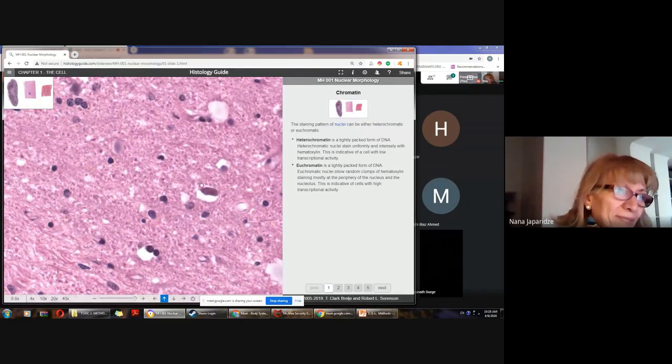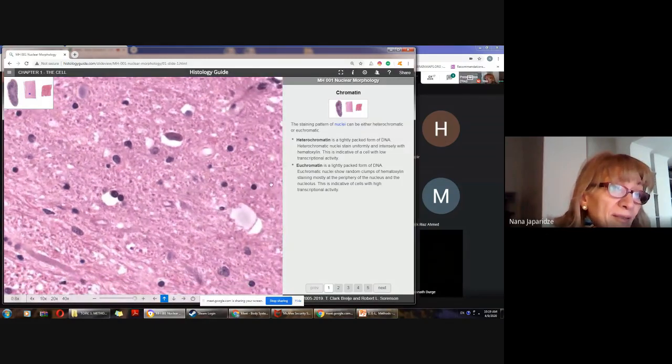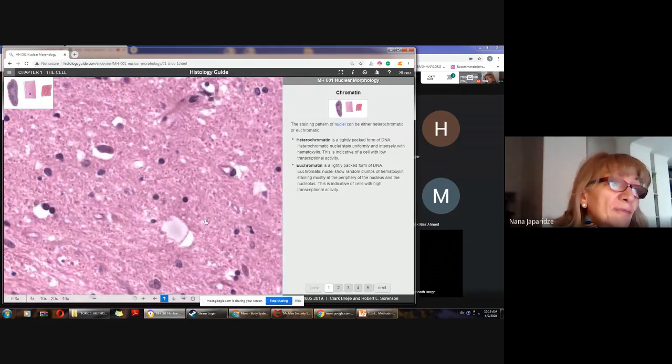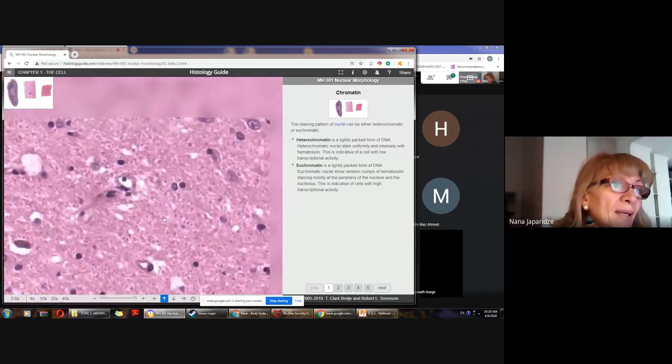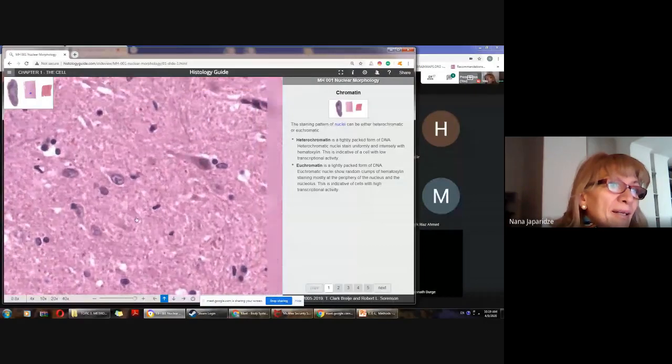This is neuron. This one too, for example. This is big one, this is small one. Also, you can see here small nucleus, which belongs to another type of cells of nervous tissue, glial cells. But what I want to show you is the big neuron.